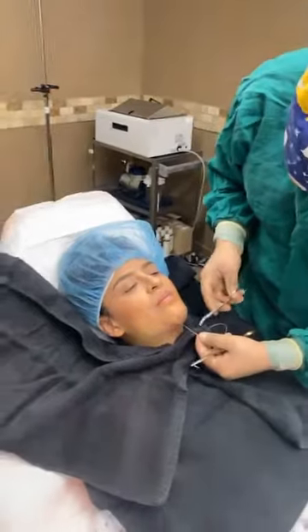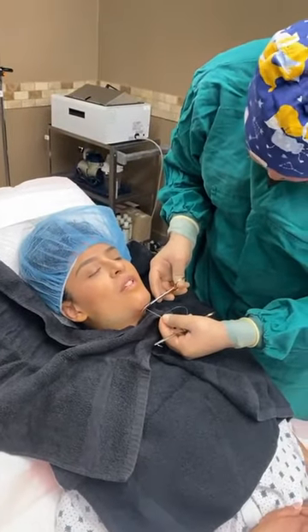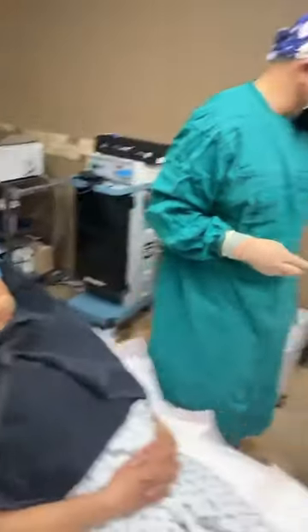They want to know what happens to the skin afterwards. It retracts back. I'm going to show you next what we do there.